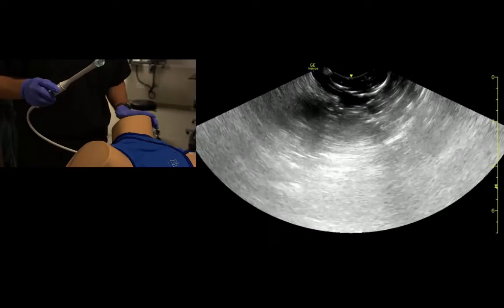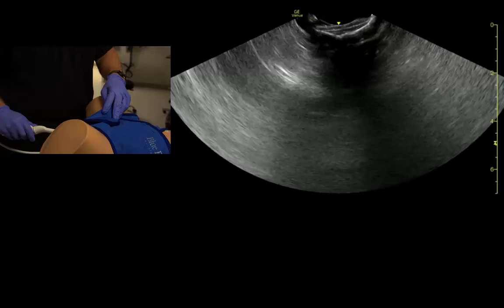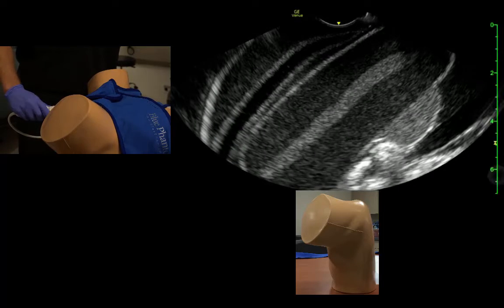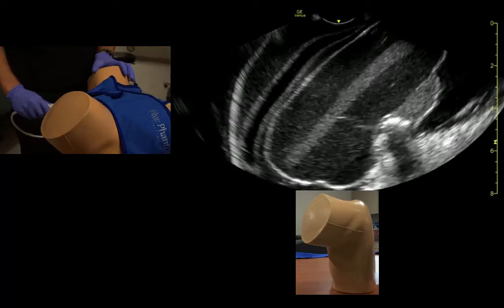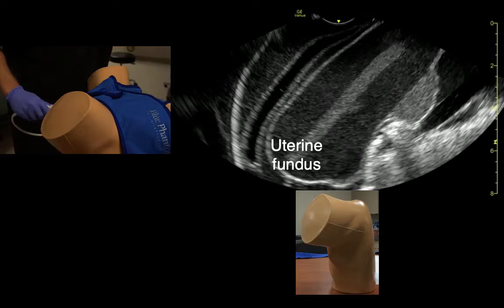We usually start in the sagittal orientation. The probe is placed in the vaginal vault and our eyes need to go on the screen as soon as we start to advance the probe. In most patients with an anteverted, anteflexed uterus, we'll see the uterine fundus at the top of the screen.